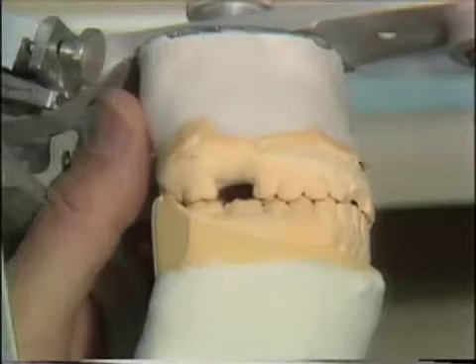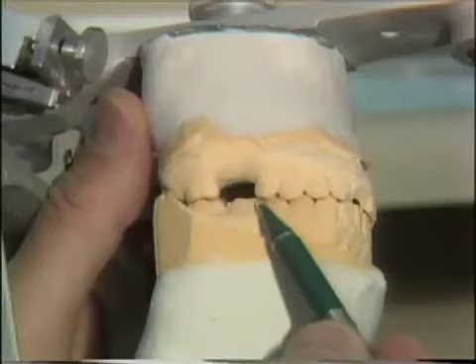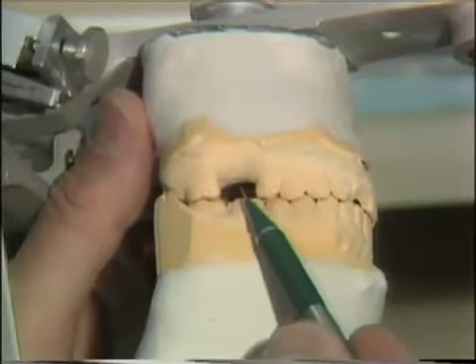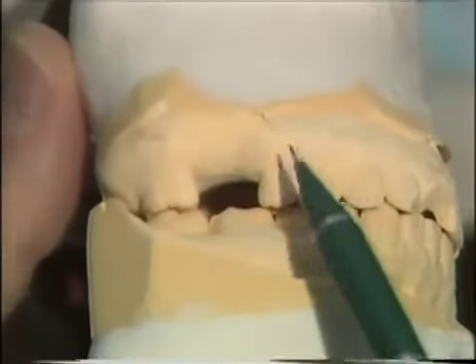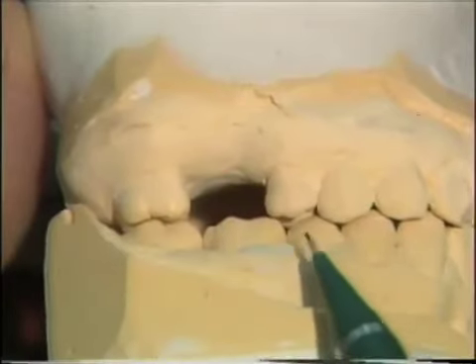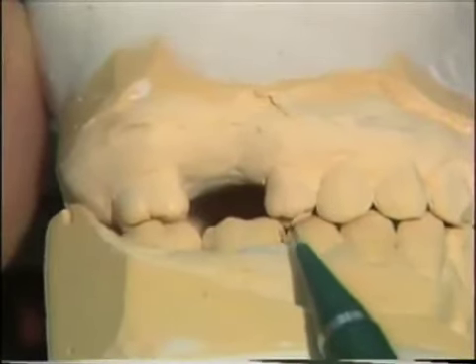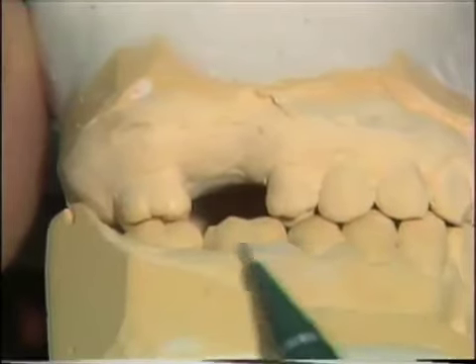We are going to prepare an etched metal resin bonded bridge on the maxillary right arch of this patient. The patient has lost a maxillary first molar, and it's important when you fabricate a posterior bridge that you mount the models so you can check the occlusion and the occlusal aspect of your bridge design. It's also important that you survey the teeth that are to be prepared. With the models mounted, you have the advantage of seeing the occlusion and the way the lingual cusps come down into the embrasures.